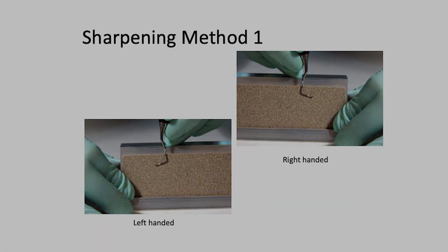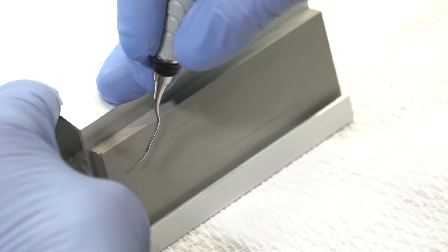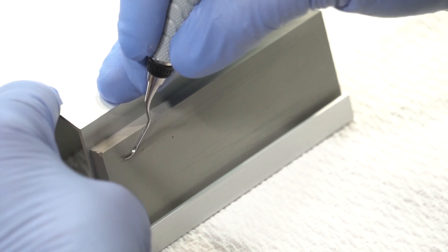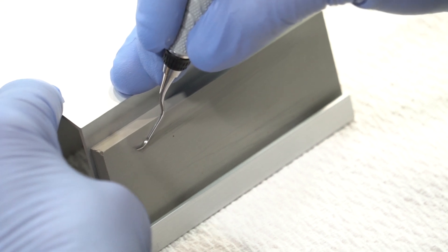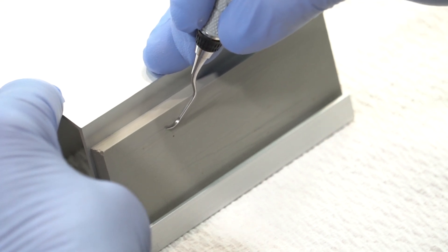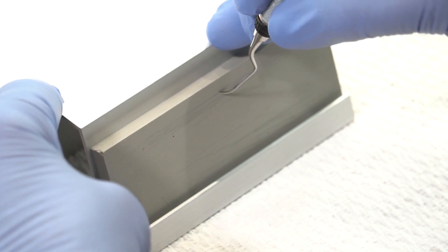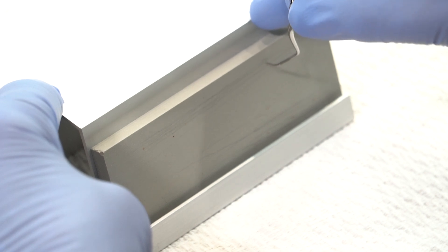Method one is with your fulcrum finger on the beam, the heel against the stone, and the face parallel to the tabletop. Move from the heel third, the middle third, the toe third, and around the toe, keeping the face parallel the whole way.